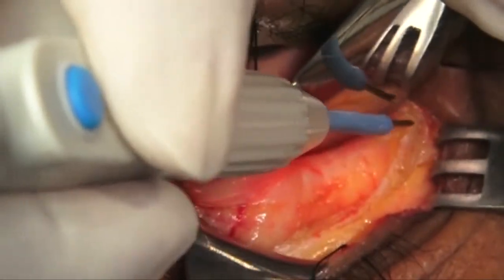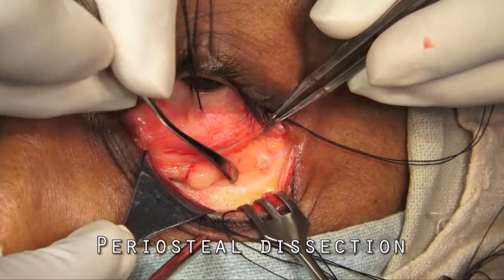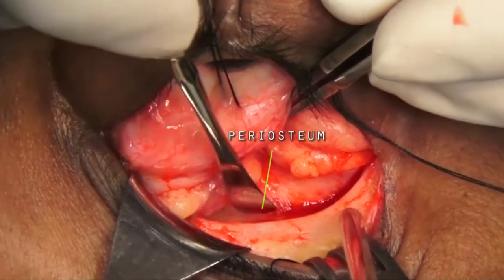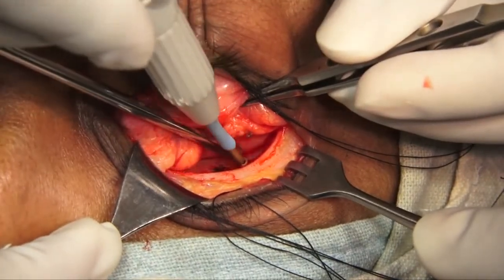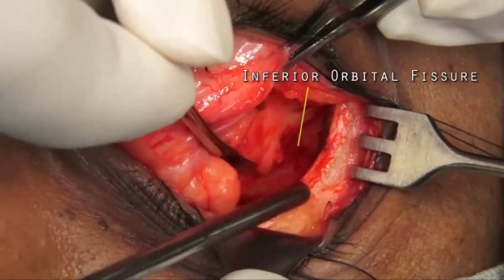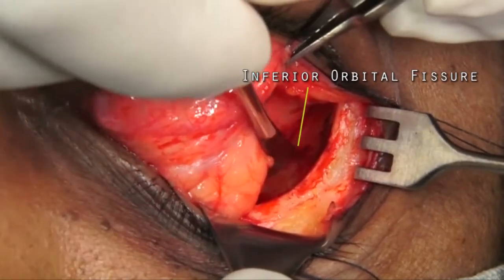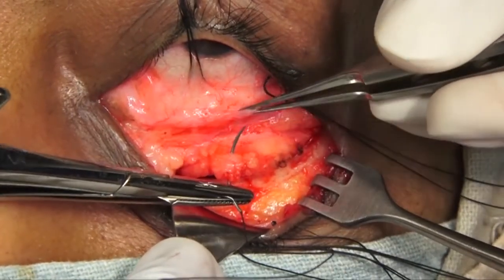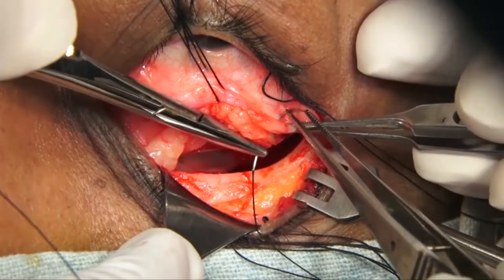Periosteal incision is made with a monopolar electrode immediately below the inferior orbital rim. Relaxing incisions are given at either end perpendicular to the horizontal incision. Periosteum is separated from the bone and the subperiosteal orbital space is approached. 4-0 silk tractional sutures are passed to retract the periosteum. Pupil is assessed at regular intervals throughout the surgery to ensure no undue pressure is exerted on the optic nerve.